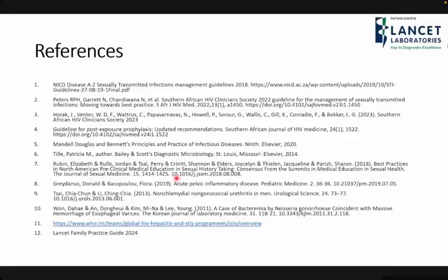So basically, following up on Dr. Mo, if I'm a clinician working in state, like most of the audience, and I'm interested in identifying an STI, we should not be using the gel swabs. A lot of times, especially in pregnancy, when somebody comes with PPROM or discharge, what we have is the gel swabs. Very rarely do we have the dry one. And you are saying that the dry one is the right one for your amplification. So the dry one is the right sample for your PCRs, but the gel one is the right sample for your culture.